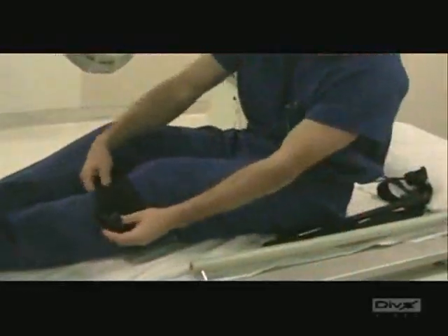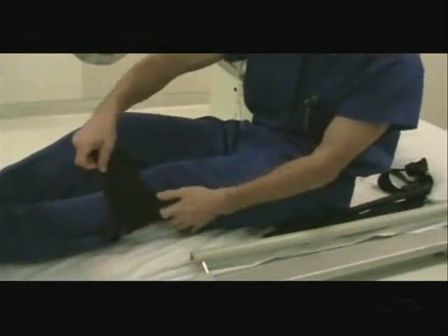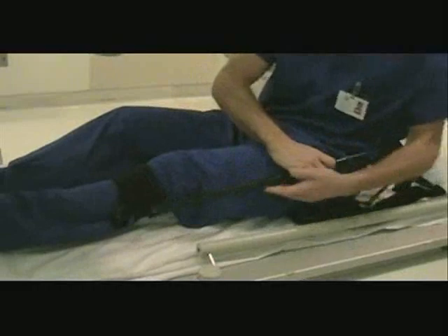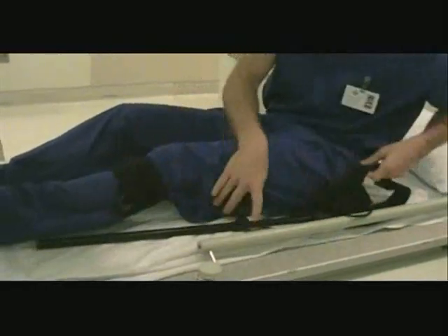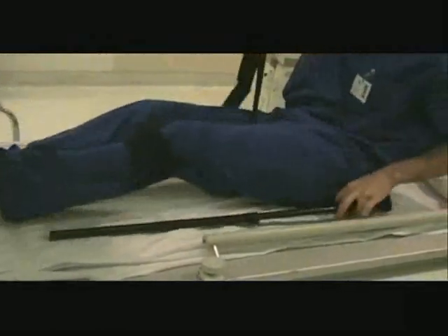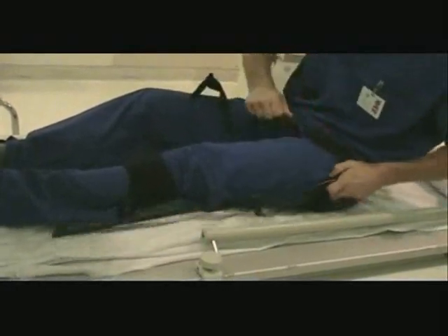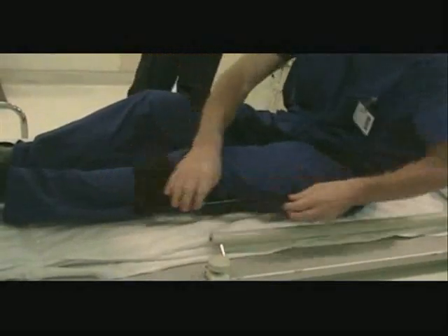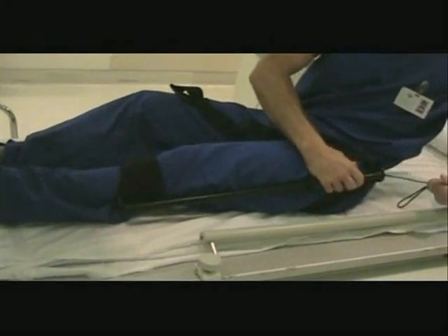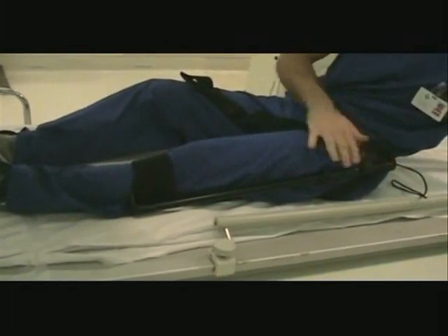I'm going to demonstrate that I can apply this to my own leg, and we will take an x-ray of it. In the film I will show what the splint looks like on x-ray. And now we're going to take an x-ray of my leg with the splint.